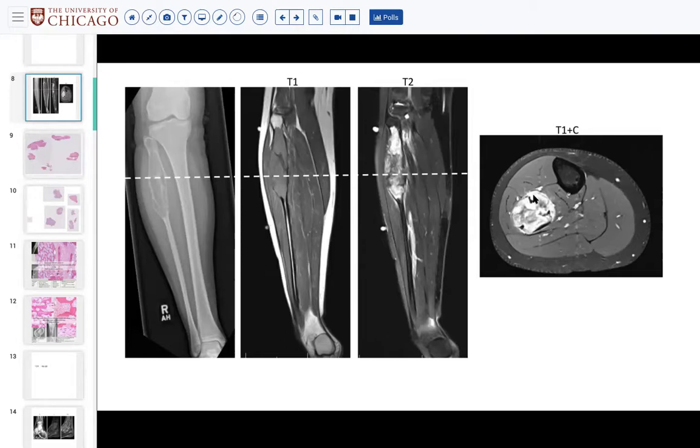You can see heterogeneous enhancement, but more importantly, you can see these 3 very dark flecks in here that have the same intensity level as bone. So you know that they're big, thick, bony trabeculae in the middle. Awesome, thank you. I always get confused with radiology, so for me, it's helpful to look at the characteristics of the normal tissue.